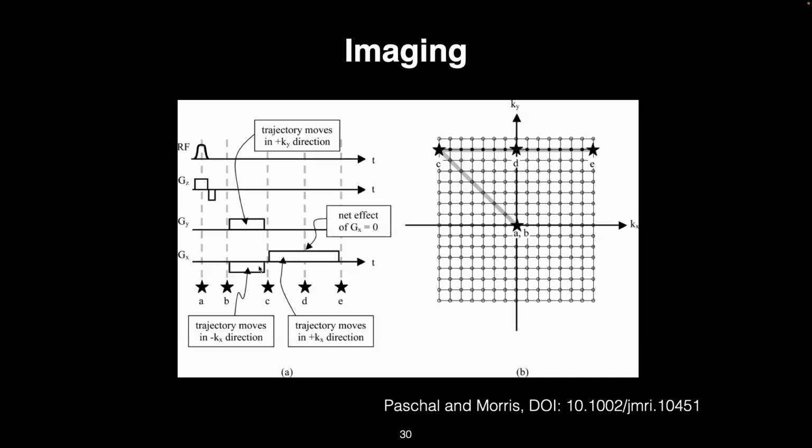So this is what we call essentially doing K-space encoding, where you track what's happening to the area of the Gx. When you take the time integral of the Gy waveform, this will determine where you are over time going along this Ky axis. So if you take the integral of Gy over time, right? You turn it on at this point here.